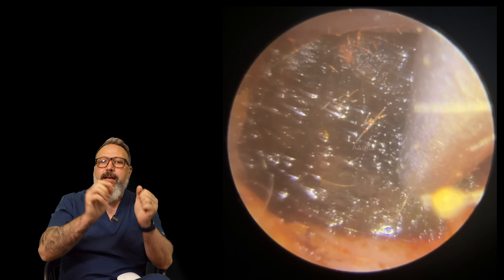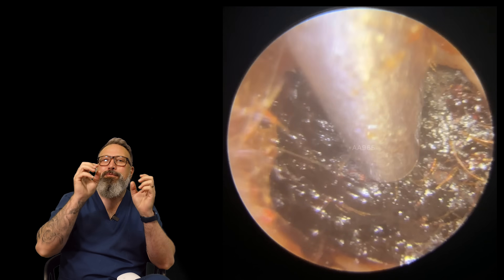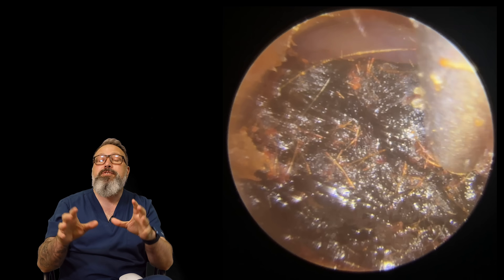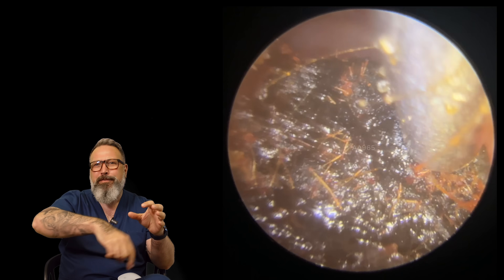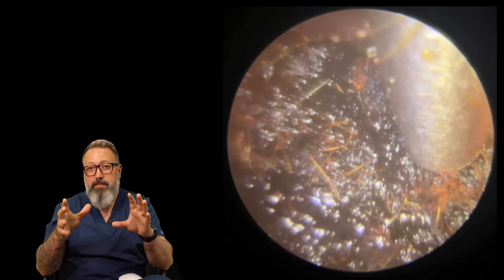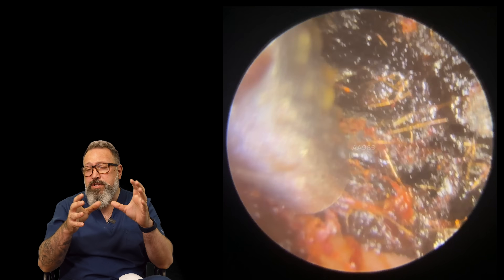Don't forget to stay tuned for the second patient - a really good example of surfer's ear or exostoses. If you're regular viewers, you'll be able to count the exostoses and see the difference. We've got a good grip on the outside edge now, starting to work this around and give it more of a pull. I'm trying to twist the wax to unstick it from the canal wall, but I can see it's quite firmly stuck on the left-hand side.